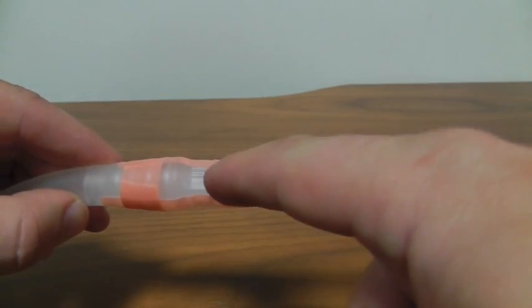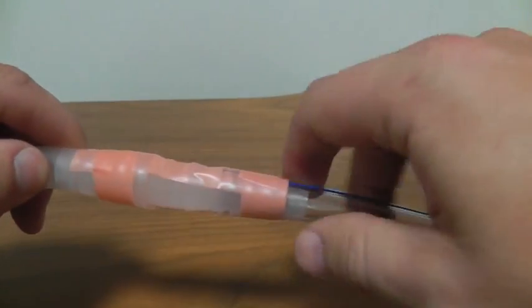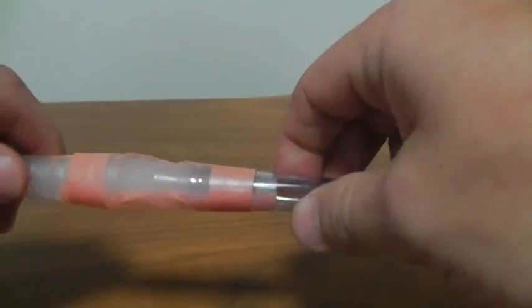This way, you can see all of the tubing, all of the connector into the drain tubing. You can see fluid going in and out. You can ensure there's no air leaks and that it's nice and secure.